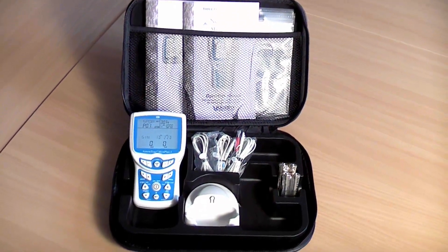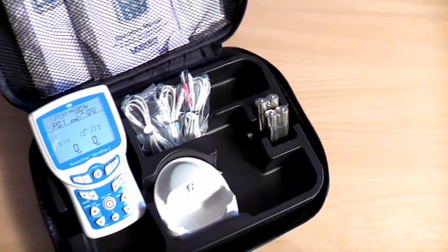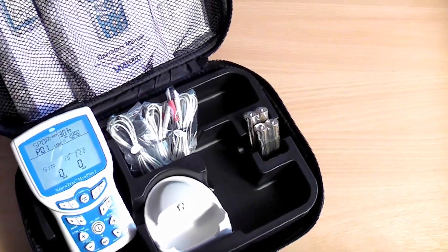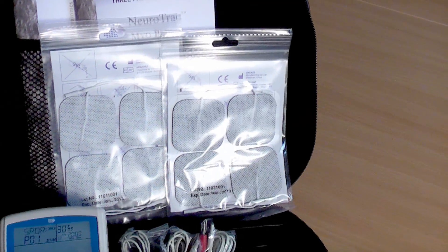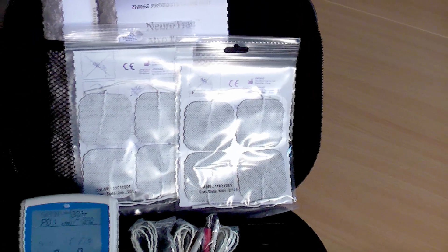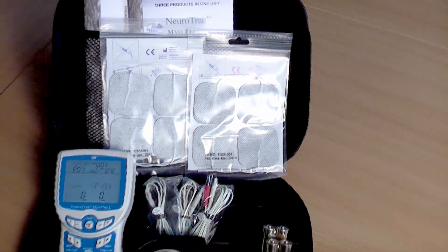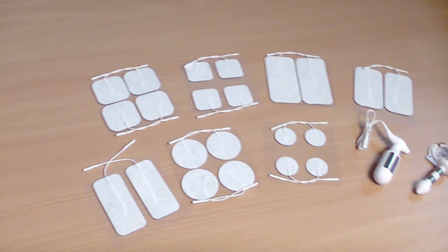Looking inside the case, you will find all you need to operate your device. All units come complete with four AA batteries, providing an initial battery life of about 13 hours. Skin electrodes are included, which are to be placed directly on your body. They work for all modalities: neuromuscular stimulation, TENS, EMG, and EMG triggered stimulation.